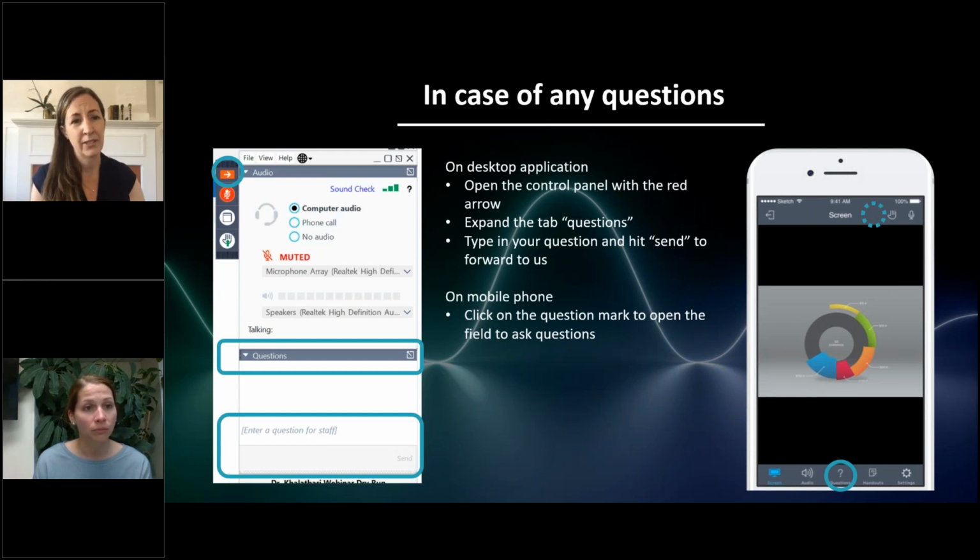Yeah, that's another excellent question. So the workhorse Humphrey that we use in clinic is really just getting the central 60 degrees of vision, 30 degrees on either side of fixation. The challenge is that the kinetic fields are not as precise and are also very user dependent. So I would love to do a study where I had the same expert technician perform the kinetic fields and see if there might be a difference. I've not had access or the wherewithal to do that. And it's a similar issue with the pattern ERG and the full field stimulus.